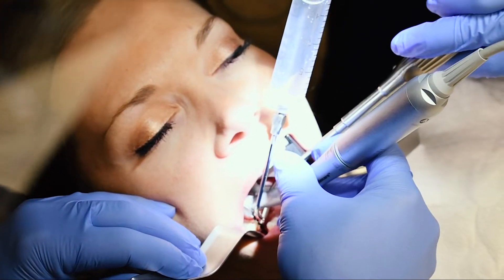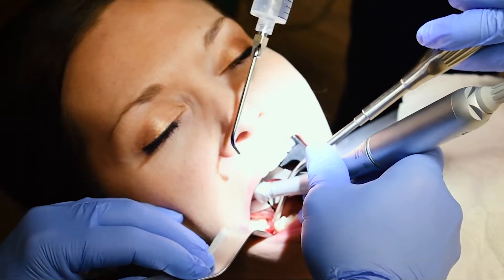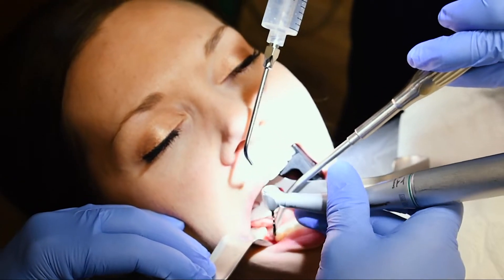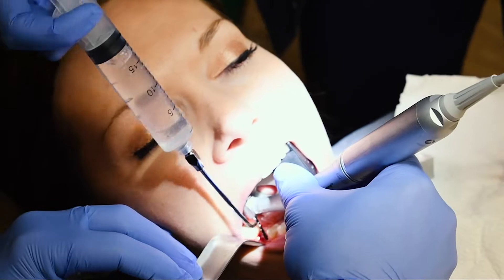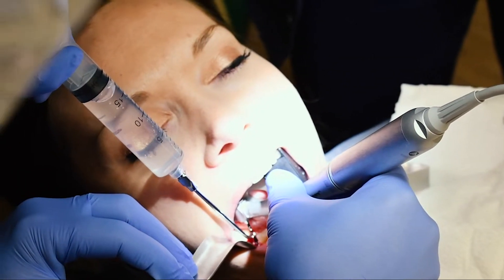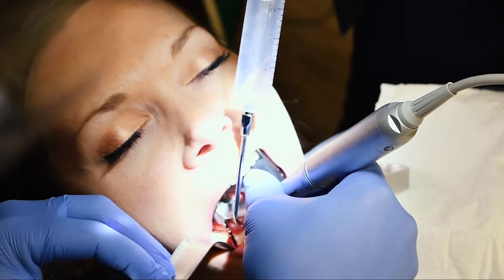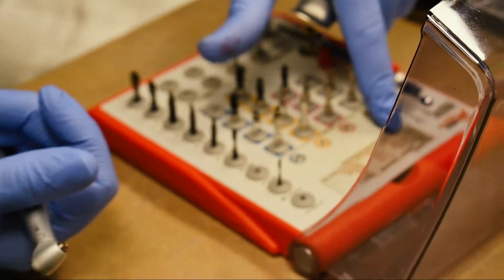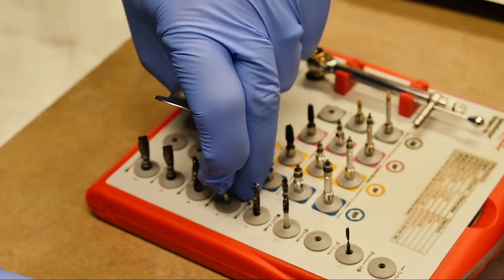Just come up for a second and go back in. This little schematic for soft bone — two, three, five. So that was two, here's three, here's five millimeter depth markings as we drill.